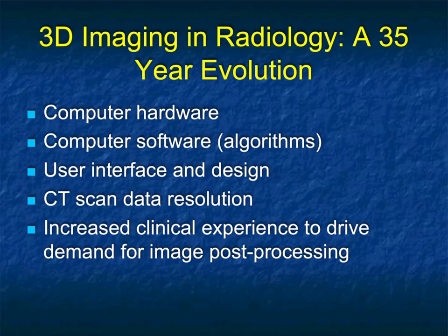We also talk about how we've gone from hardware and hardware-based performance to algorithms that take advantage of specific hardware. We talk about how we've changed from basic hardware, big boxes, think Silicon Graphics, think Pixar, to small chips from NVIDIA. Things that were hundreds of thousands of dollars are now hundreds of dollars. The performance to cost thousands and thousands of times different. We talk about, because of new computers, the ability to have better user interfaces. You don't need to be a computer expert to be able to do a case.